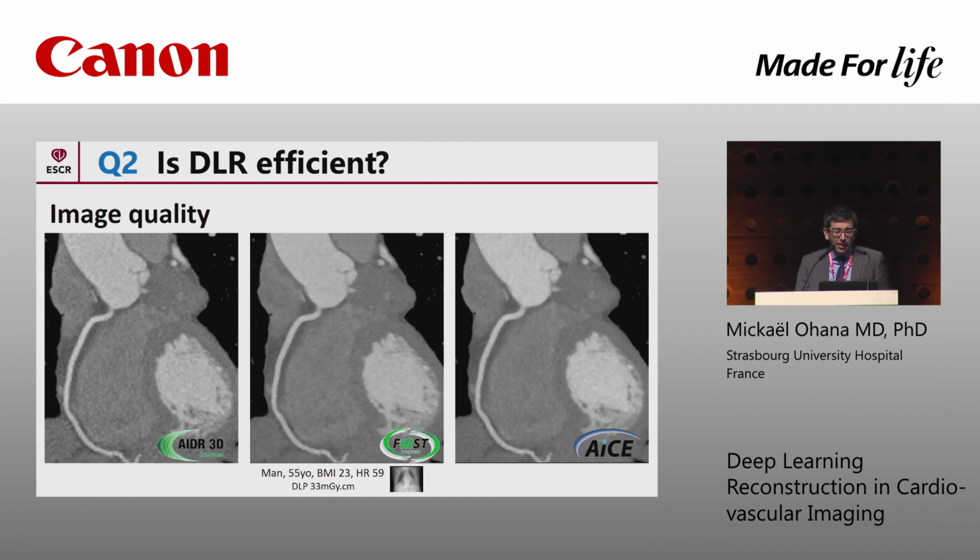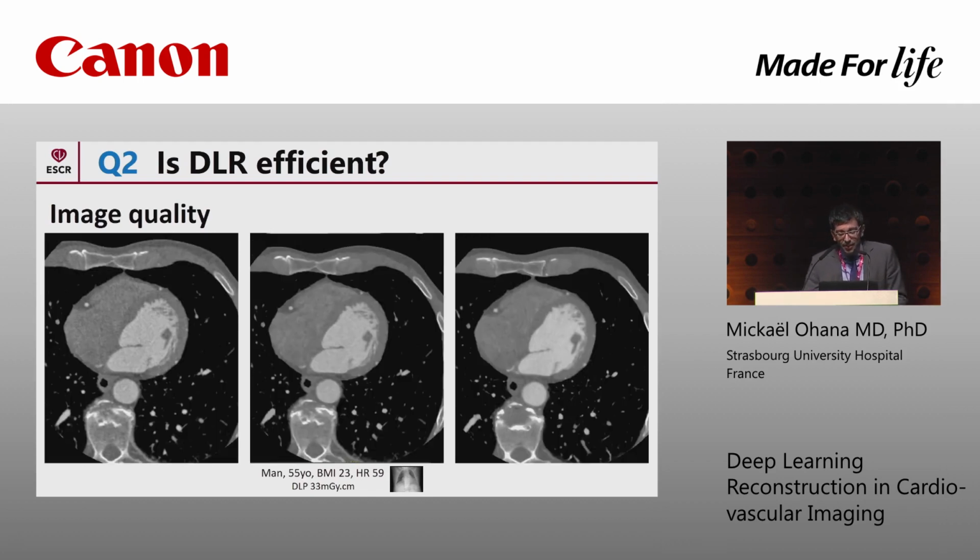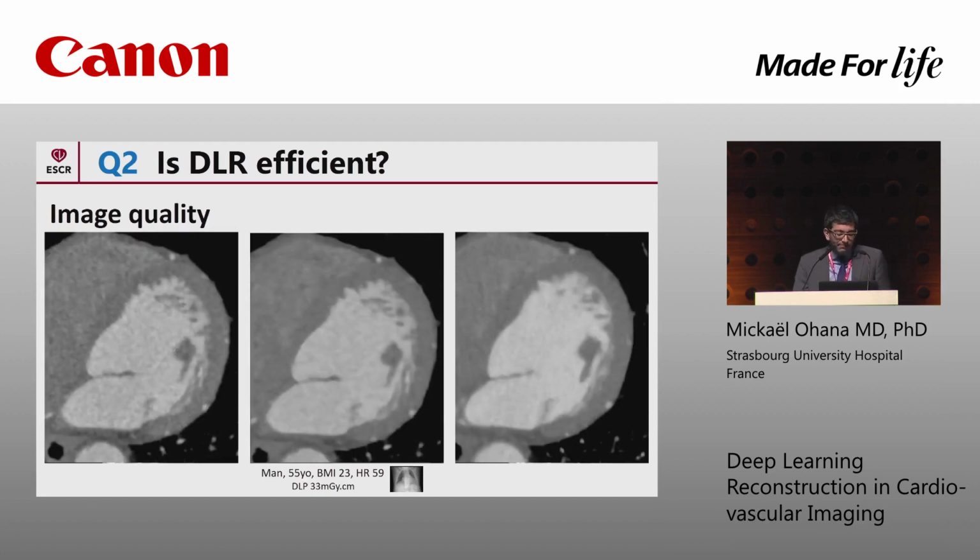When we look at the initial axial slices, and when we zoom in, then you can recognize a little bit of the defaults of the MBIR algorithm, that the appearance of the images is not really natural. When you look, for example, here at the myocardium, it's smooth, there is no noise, but it doesn't look natural. When you look here at the shape of the trabeculations, or for example the borders here of the LA, it's nice, there is no noise, but the appearance is not satisfying.